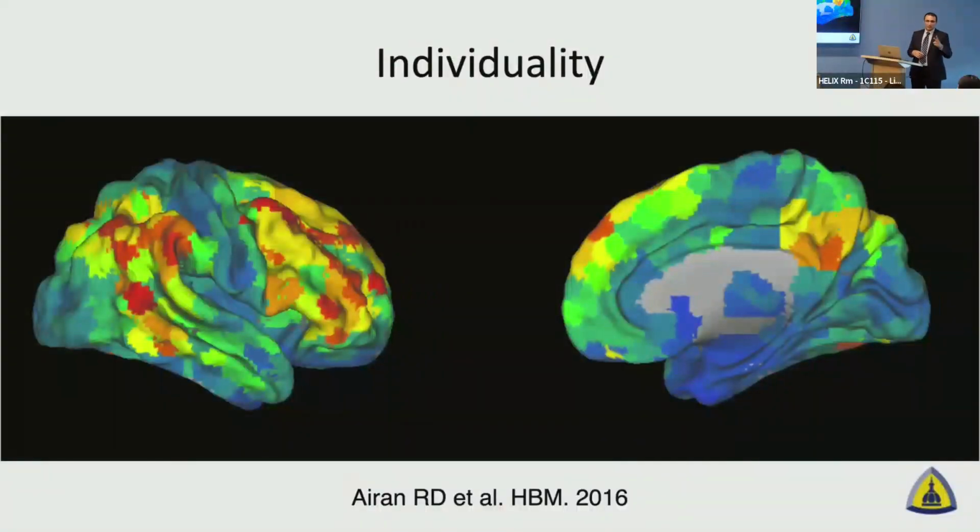So let's say everybody here had 2 scans, time point 1, and several days later, maybe a week later, another scan, right? Now, I don't know how many people are here, but let's say there's 30 people. So now I have 60 scans. What we do is we dump those 60 scans into an algorithm and ask it to pair up, just using the functional connectivity matrix data, which 2 belong together.